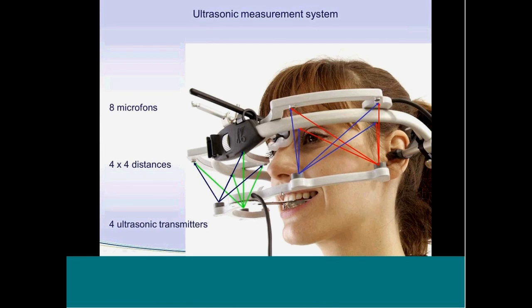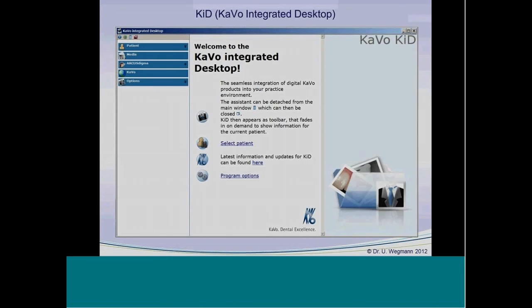All this data will be stored first on the Digma and then transferred to the computer via USB. It is online, or via memory card, and you have some time difference, of course. If your computer is connected with a monitor in front of your patient, the patient can follow these measurements and see online the real movements on the screen. But that's something I will show you later on.